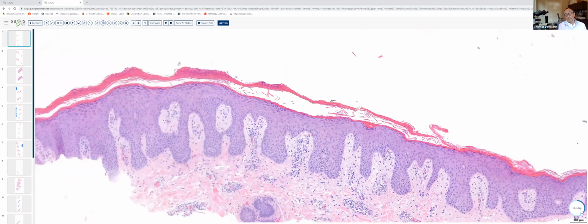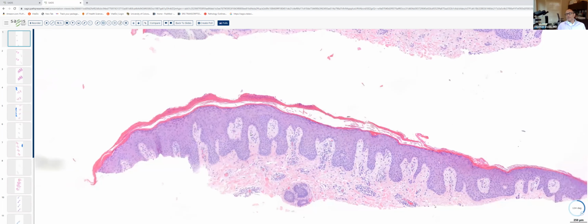Dermatophytosis can really mimic almost any of the patterns of skin disease that we see. A clue that should make you take the time to look for fungal elements in the cornified layer, or in the sections in general, is neutrophils within the stratum corneum. Anytime one has a spongiotic dermatitis on a volar surface, palm or sole, it's a good idea to scrutinize the cornified layer for fungal elements and even get a PAS or GMS if that's available to you.